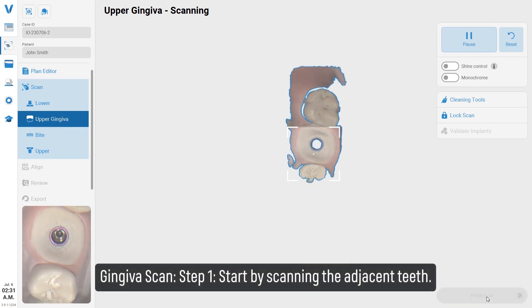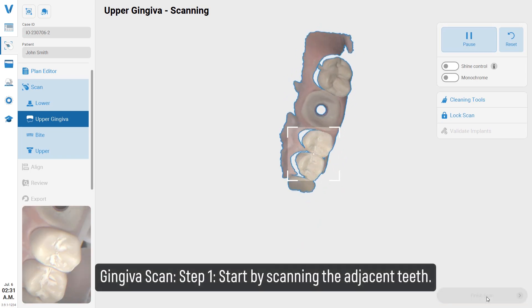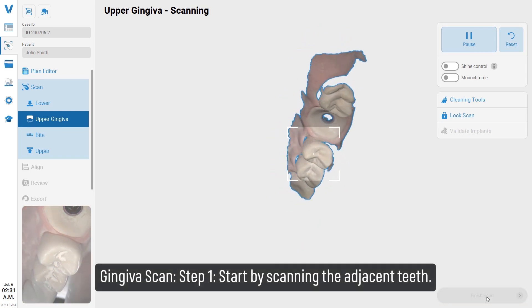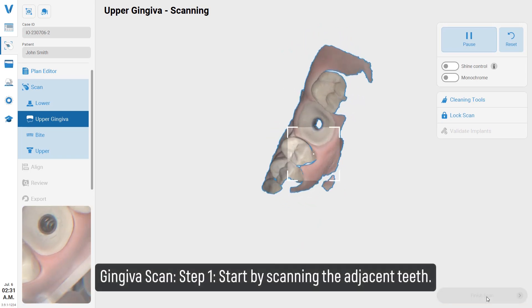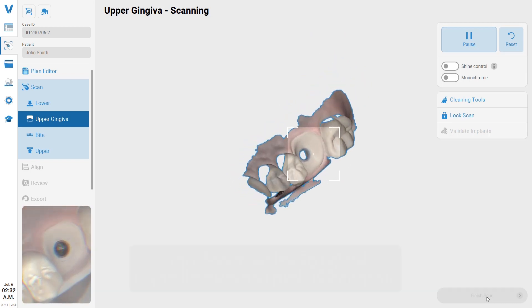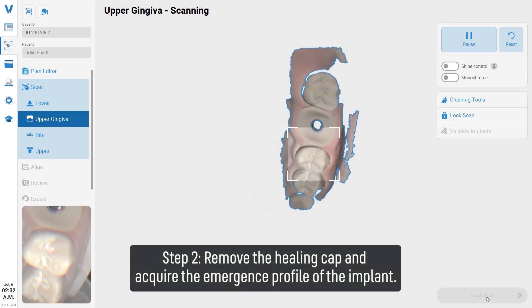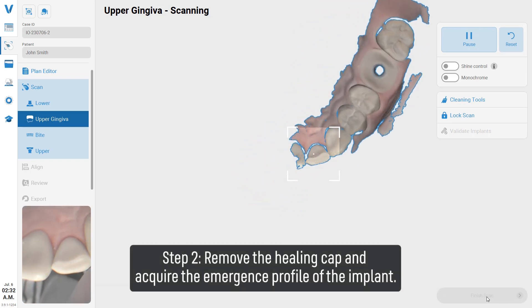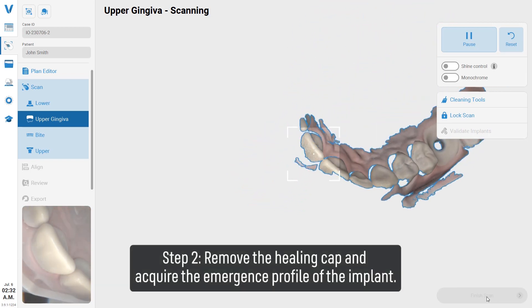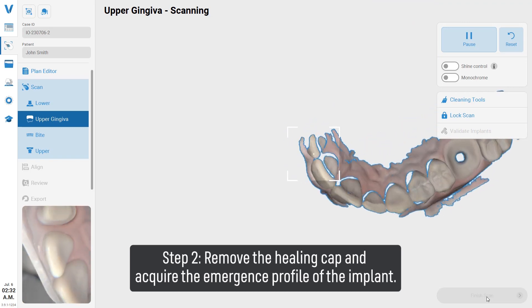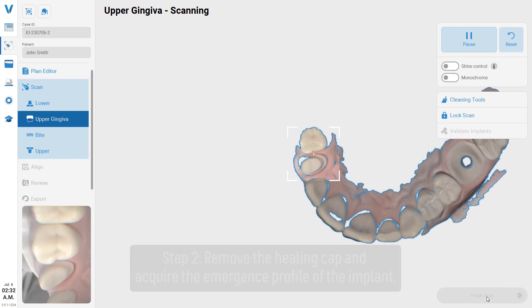Gingiva scan step 1: start by scanning the adjacent teeth. Step 2: remove the healing cap and acquire the emergence profile of the implant.